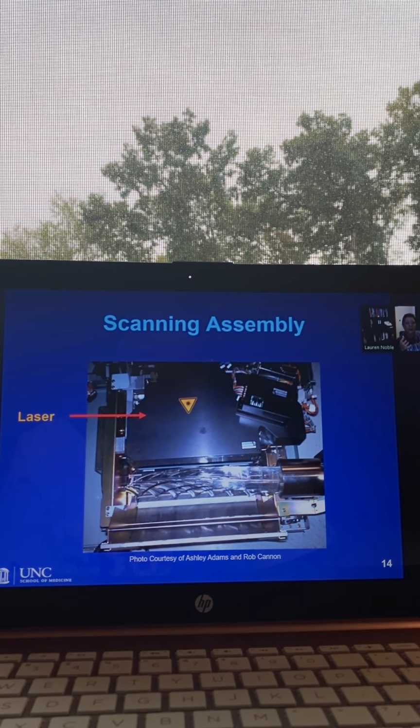And then those electrons, they're in an excited state. We don't want them to recombine back with the barium fluorohalide. So the europium is there to serve as a trap. So it will trap those electrons. That's our image data.